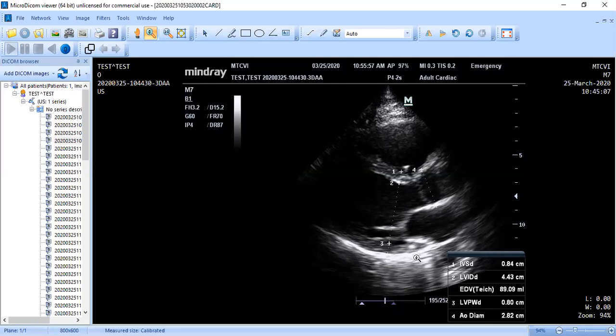Okay, bear in mind these images are during diastole. Okay, so if you see here, we have just scrolled basically to when the mitral valve closes. Right when it closes is when we want to take these measurements. So both valves are closed, so we're getting ready to be in our isovolumic contraction time because the ventricle is in diastole, so it's getting ready to start systole. But we're just not quite there yet. So we want that mitral valve to be closed. That's when we do this measurement.